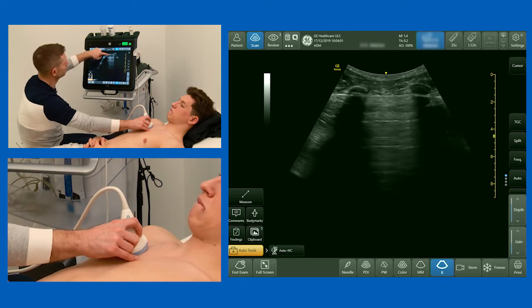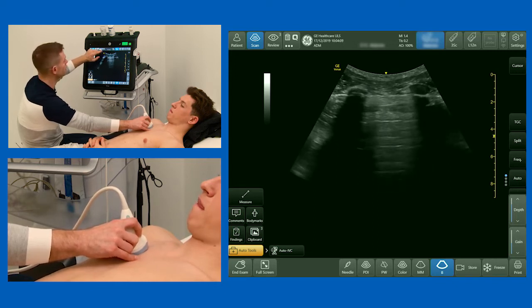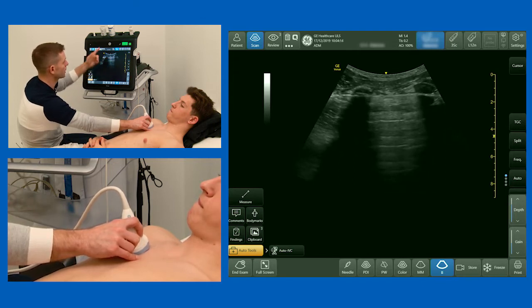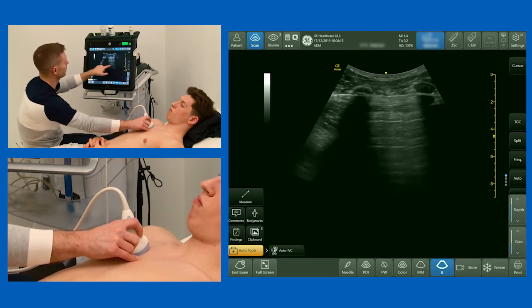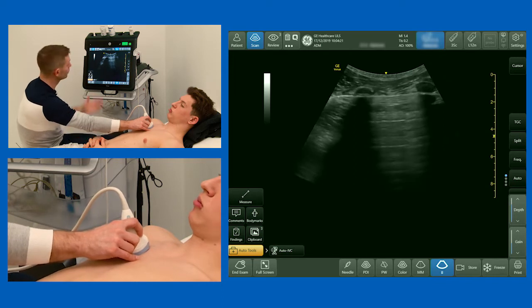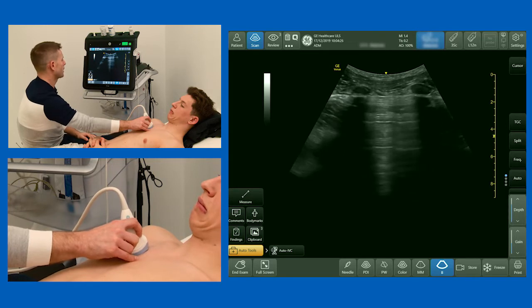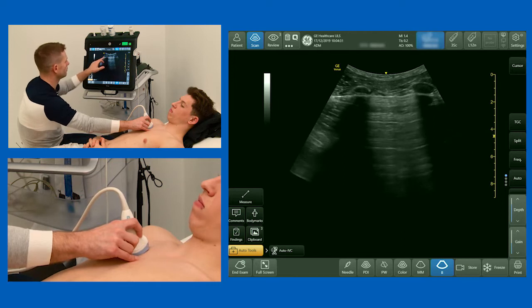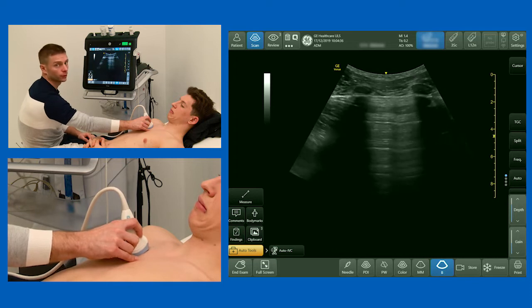Some of those sound waves, when they hit the pleura and bounce back to the probe, bounce off the probe and back down to the pleura again — they've bounced backwards and forwards twice. That generates a second white line which looks like the pleura. Some bounce three times, generating a third line; some four times, generating a fourth line, and so on. These artifactual representations of the pleural line are called A-lines, and they signify that there is air below the pleural line.